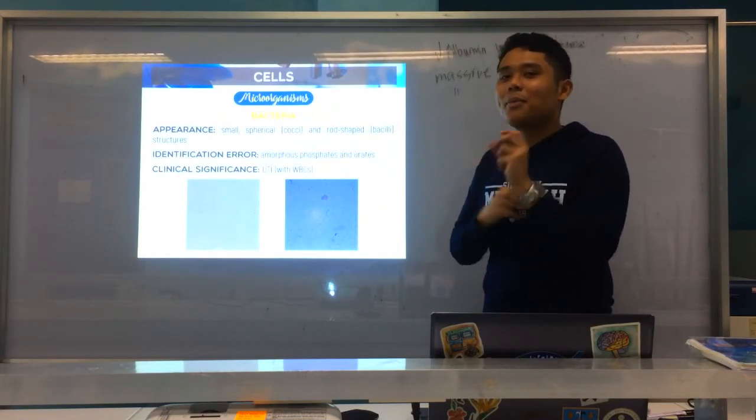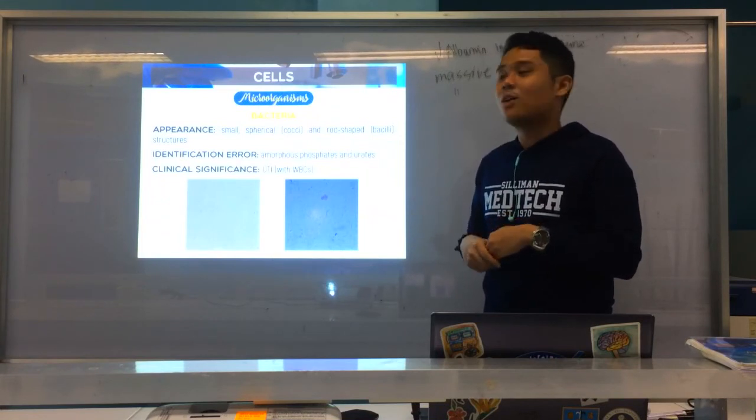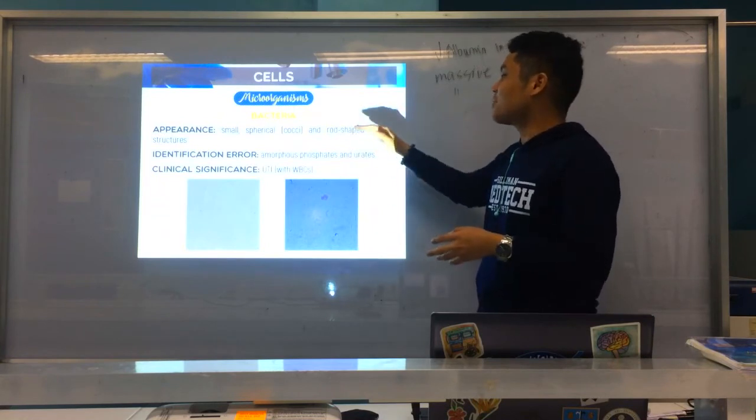If na dyan ni-answer cocci, bahalang nakathink man gani mo na cocci ang E. coli. Nako, sinasabi ko talaga sa inyo. Charot, okay. Again, E. coli is bacilli.